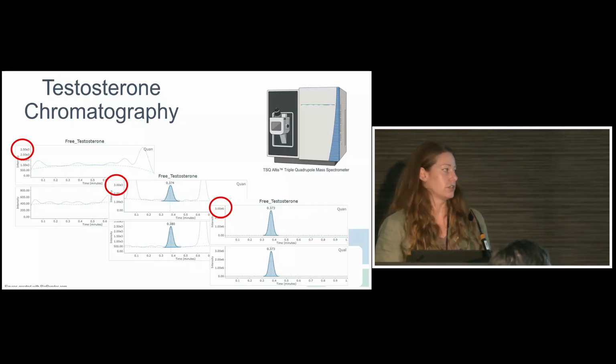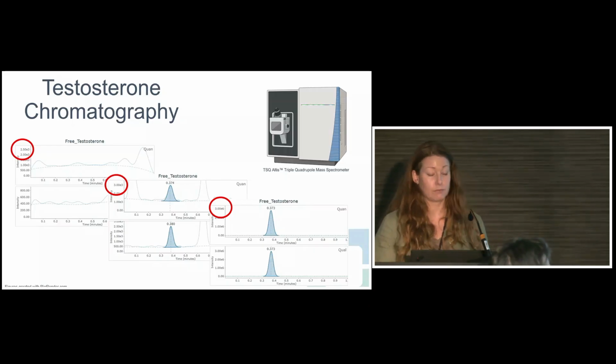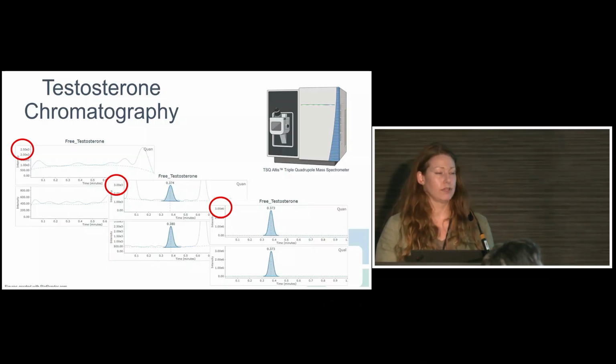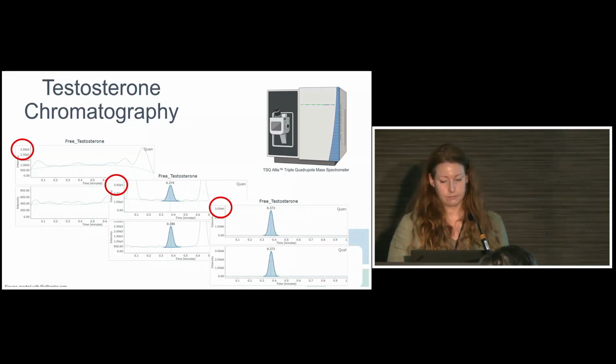And that just ensures that we're not getting any carryover signal or just intermittent signal that might not actually be testosterone, or something that's contributing from one of our consumables, and that will eventually help us trace things back to a root cause if need be.